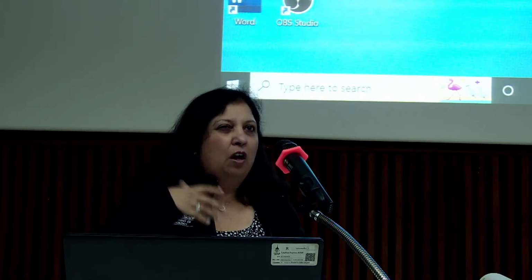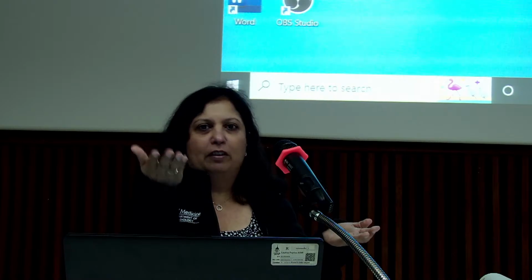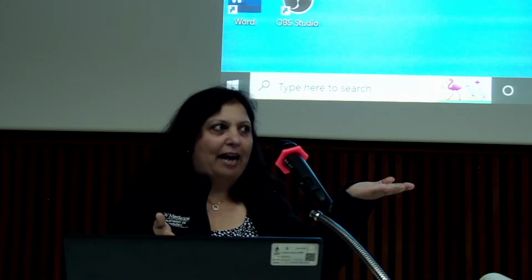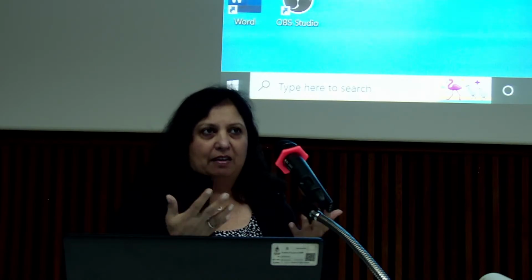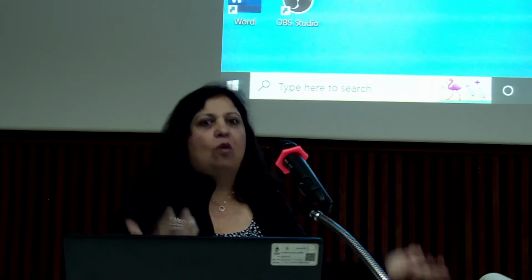And so you do not want to have so many alerts that you're sending all these emails to the attendings. So again, it's a balance, just like CT alerts. How much do you want to bother your interventional radiologist, but at the same time, you want to make sure that if there is a skin reaction, you catch it. So that's why we picked 5 gray. And actually, I'm thinking we should go even higher, because I've heard some physicists and some hospitals pick 8 gray, because you don't really see reactions. In all the time I've done this, I've maybe seen it once. And again, if I get 5 gray and Sam gets 5 gray, you might see the skin reaction on me and not on him. It just depends on so many factors. So that level is decided locally, based on what you want.